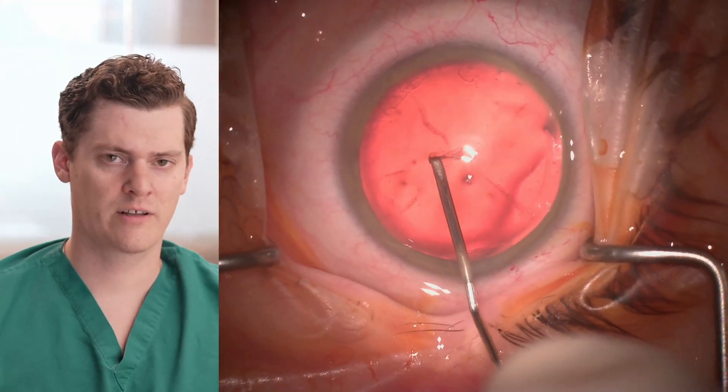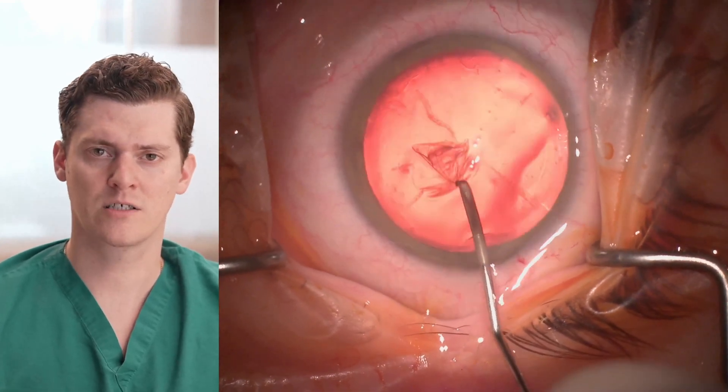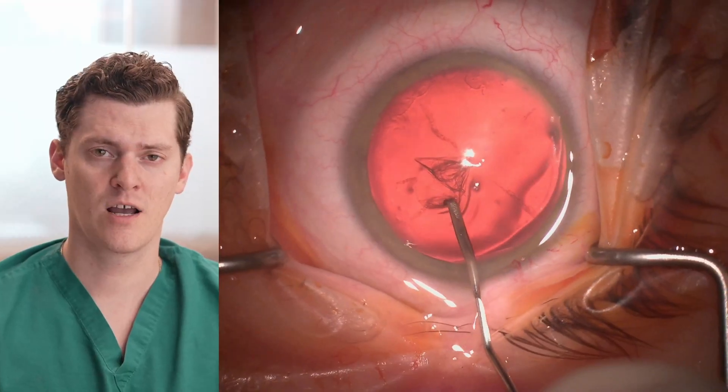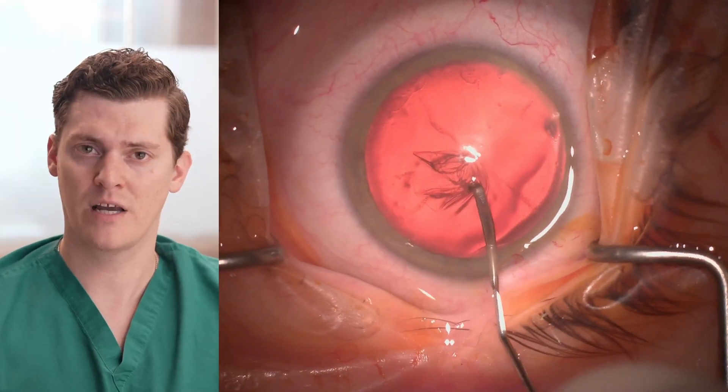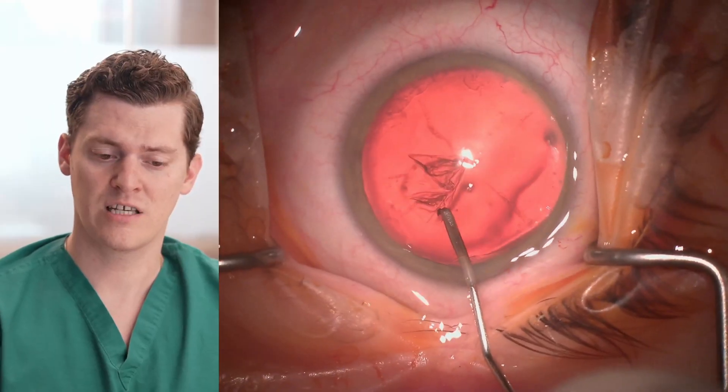Here you see me starting the capsulorhexis with the cystitome. Typically, I start the capsulorhexis with either Utrata forceps or MST capsulorhexis forceps. However, in this case, they weren't readily available, so I started it with the cystitome.